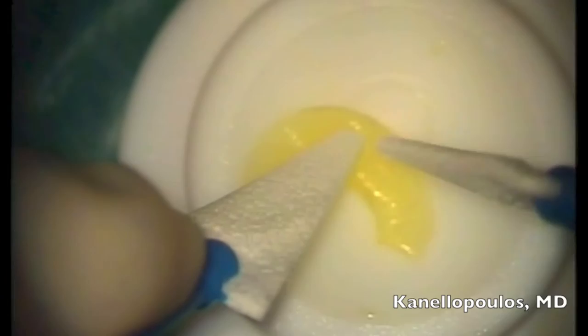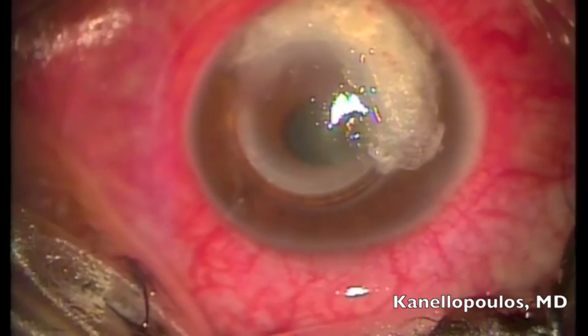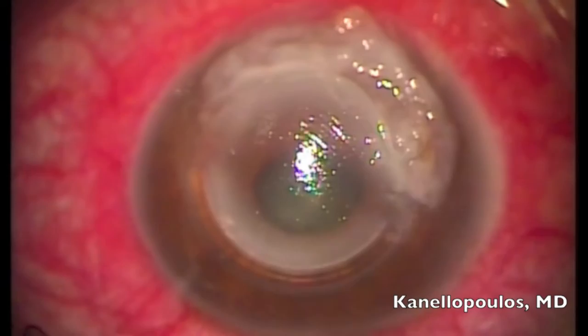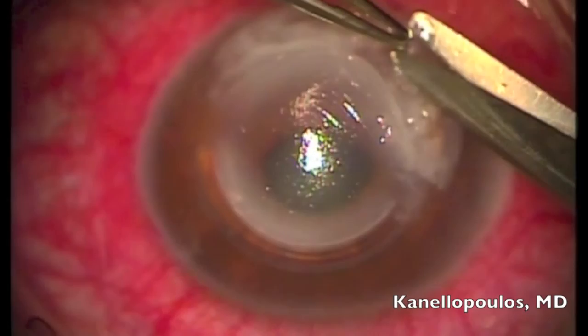I'm removing the residual epithelium. You can see the riboflavin placed on the patch graft. This is the eye with the glue — it has been already 6 days. The glue comes out really readily, and you can see how the cornea over the INTAC has melted.